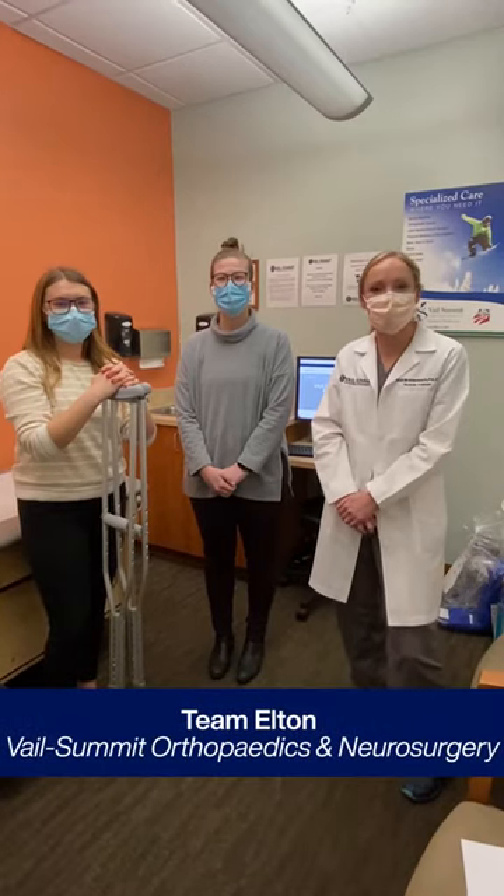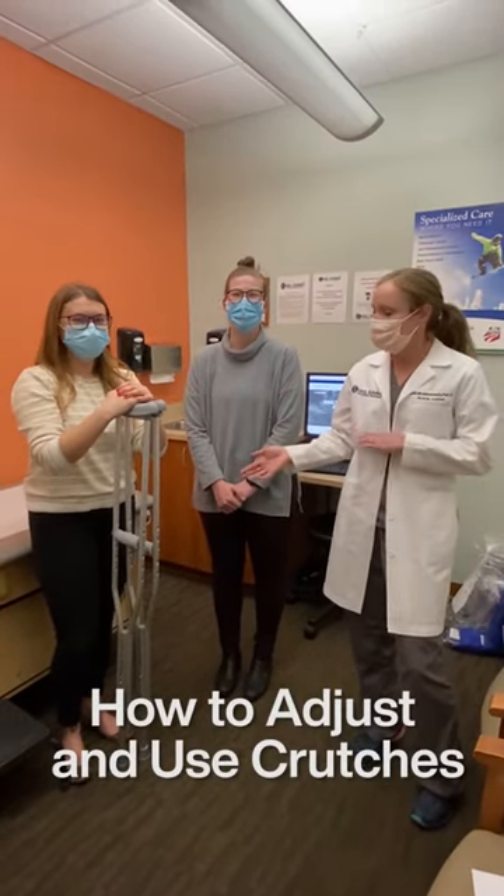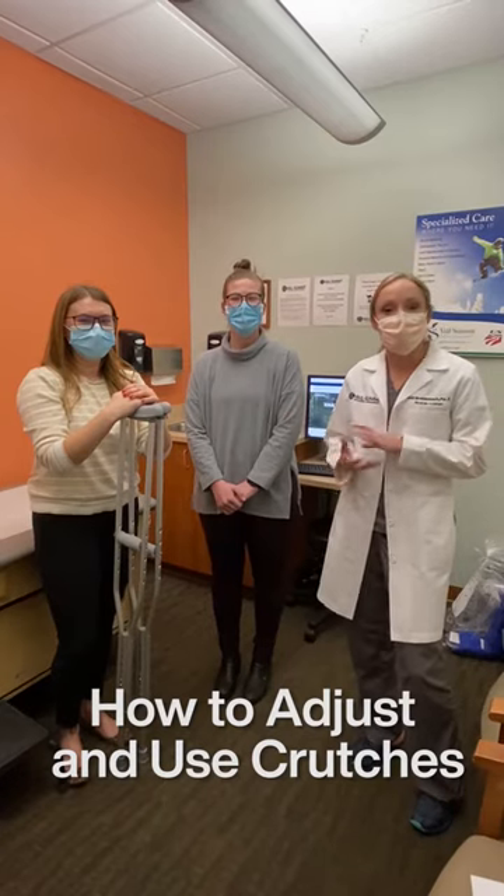Hi, I'm Kelly. I'm a PA with Dr. Elton at Vail Summit Orthopedics. This is Amanda and Abby, our athletic trainers. Today we're going to do some crutch training and show you how to adjust them appropriately.